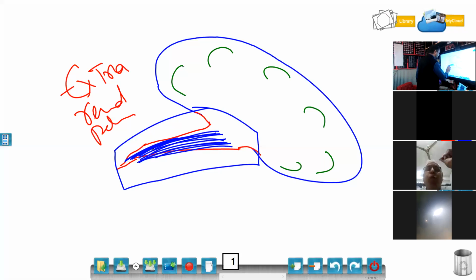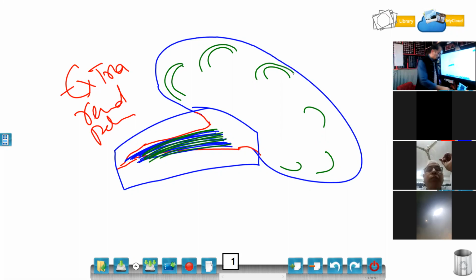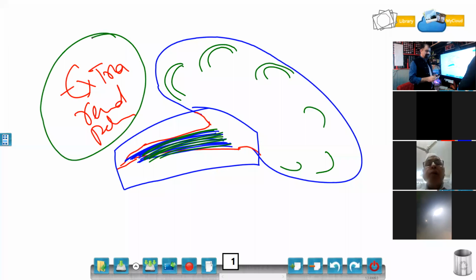If you are seeing this type of picture, you have to ask yourself why there is no hydronephrosis. So a missing hydronephrosis is giving me a clue that I am dealing with an extrarenal pelvis.